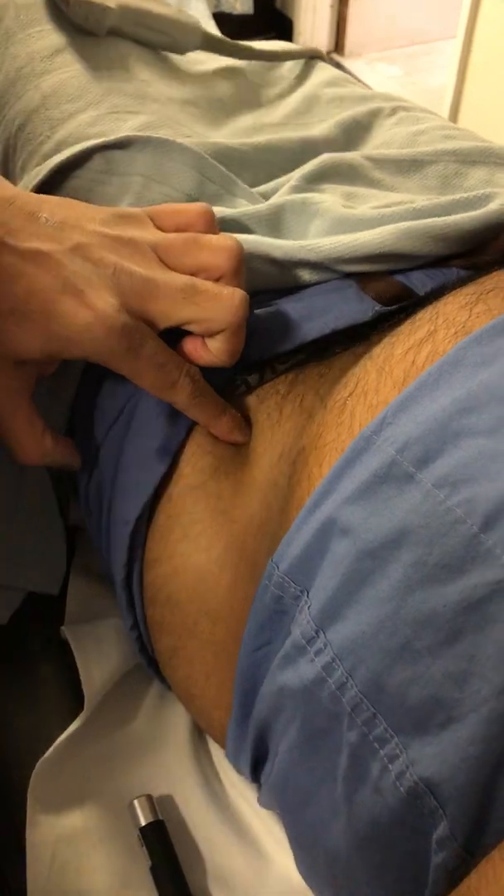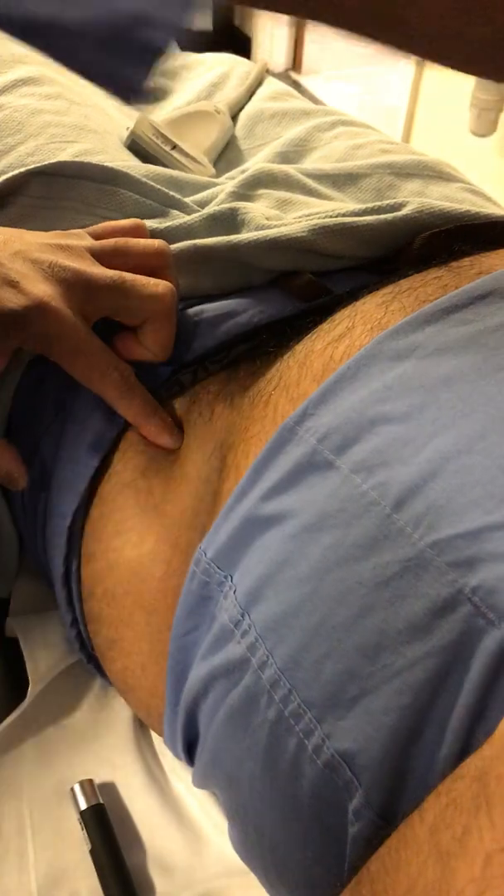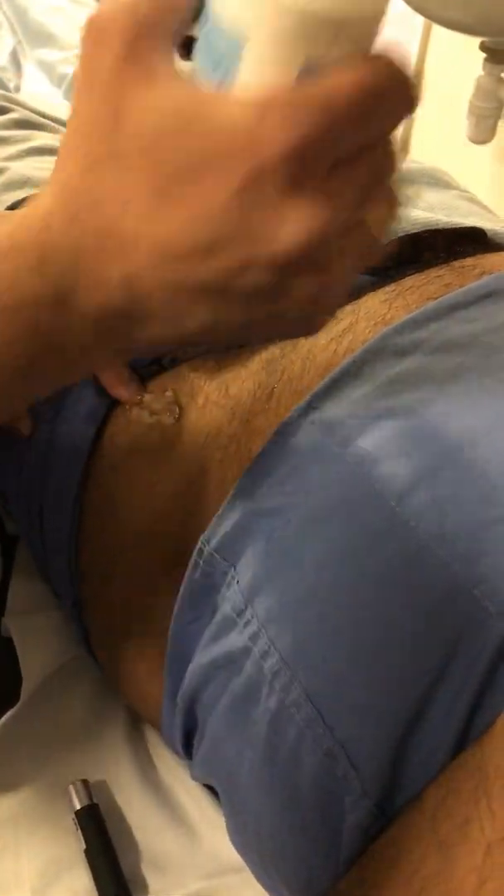Then you ask the person to lift the leg and you feel the groove between your TFL and your rectus femoris. And then you will put your probe there in that groove.